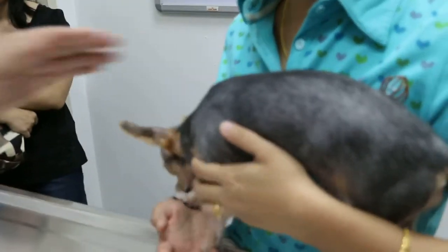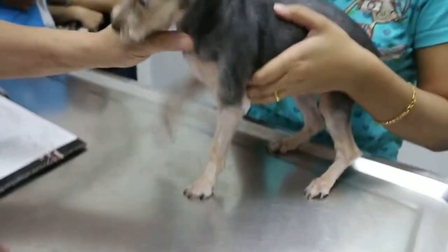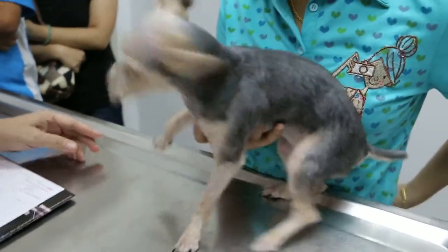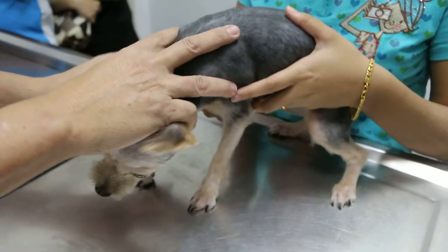April 5, 2015. This is an educational video to teach how a dog is checked before spaying. This is a female Yorkshire, 6 months old, coming in for spaying.